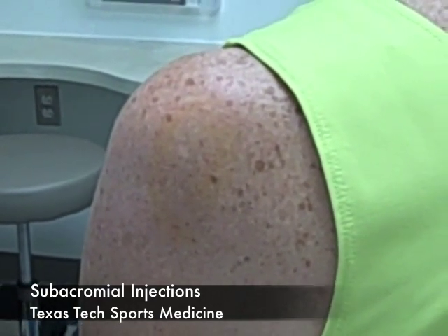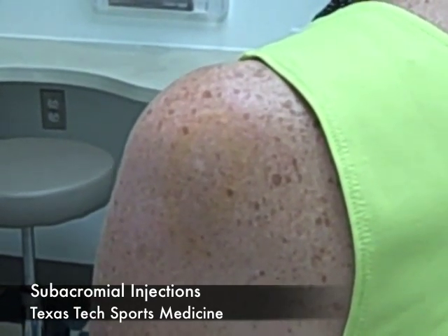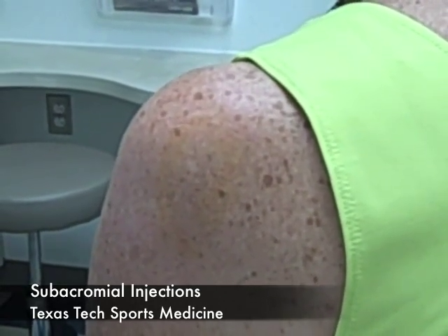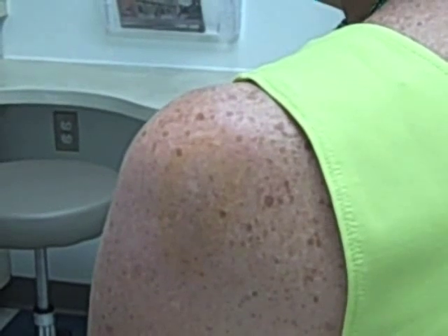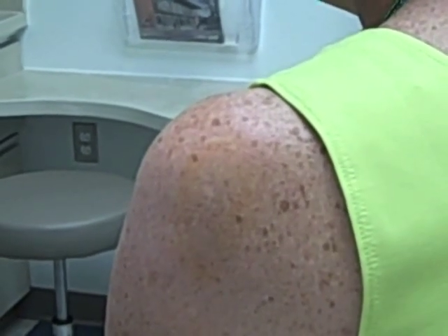We are going to demonstrate the technique of a subacromial shoulder injection. The indication today is impingement syndrome and partial rotator cuff tear. The main goal of the injection is to give pain relief. The risks and benefits of the procedure are reviewed with the patient and the appropriate consent signed.